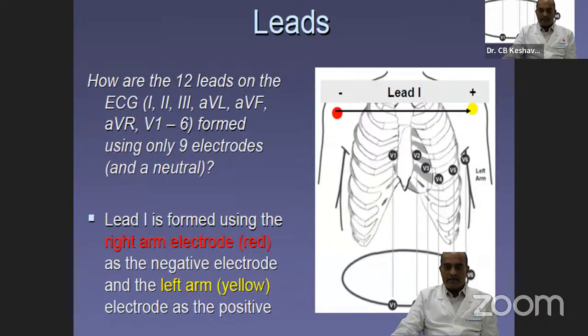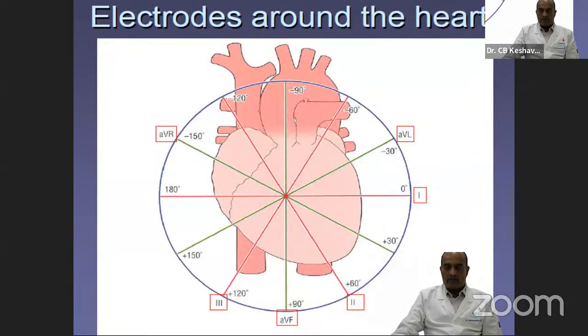In a standard ECG machine, all these are color coded and they are labeled independently so that there should not be much confusion. The only thing is where we place the lead on the patient and how we put the gel. Suppose we put the ECG electrode gel as a smudge, across all the leads will be connected, then the voltage reading may not be appropriate. So red stands for right arm, yellow stands for left arm, and green stands for the left leg. So that is how you place the leads properly. It is color coded. Internationally, the same coding is used so that across the world, it should be the same.